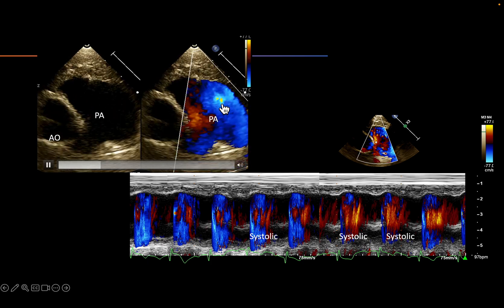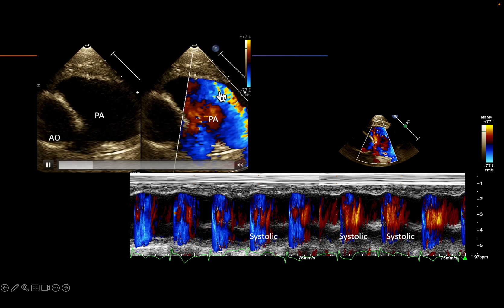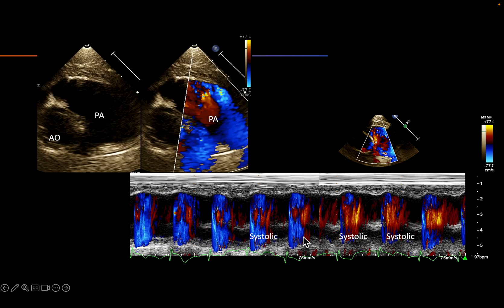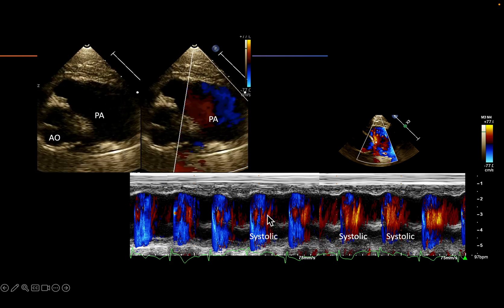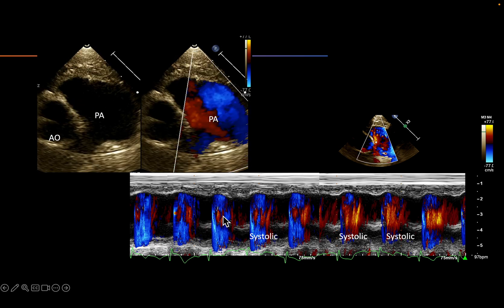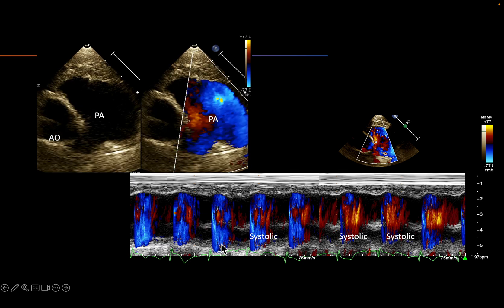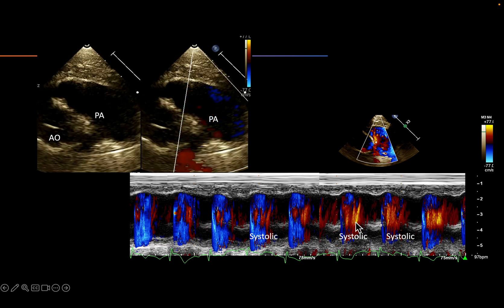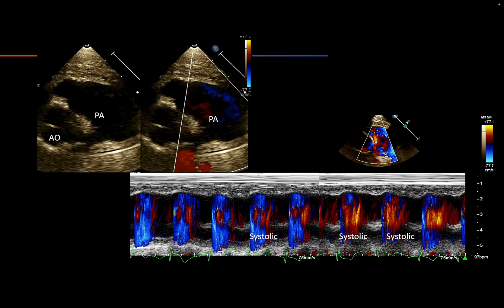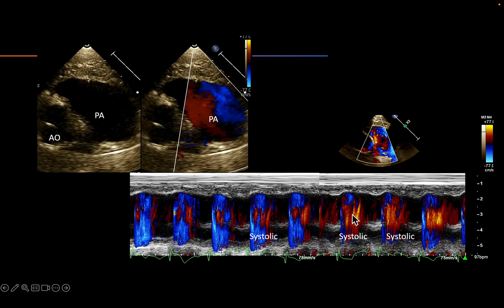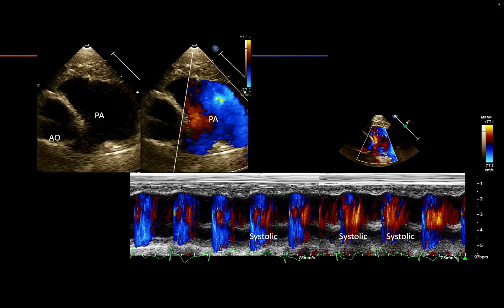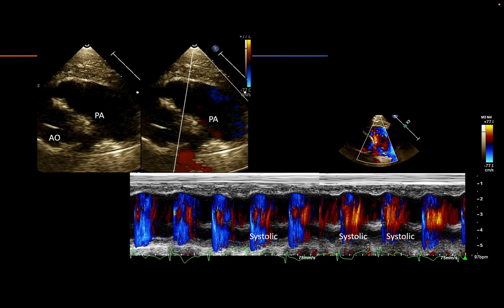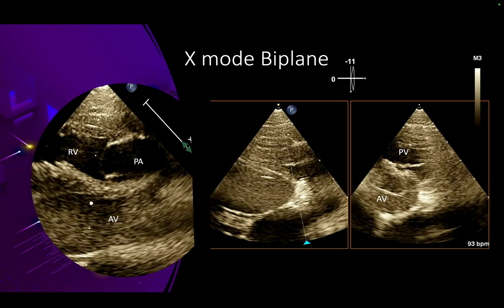On M-mode, you see this is the systole and in the systolic frame you see flow both forward and away from the transducer shown in blue. Moving slightly medially with the M-mode cut, this flow is not diastolic flow like we see in a PDA - this is systolic flow due to encircling of blood caused by dilatation of the pulmonary artery. We see this pretty commonly in patients with dilated pulmonary artery of any cause.